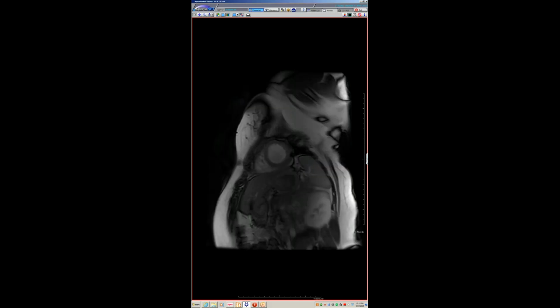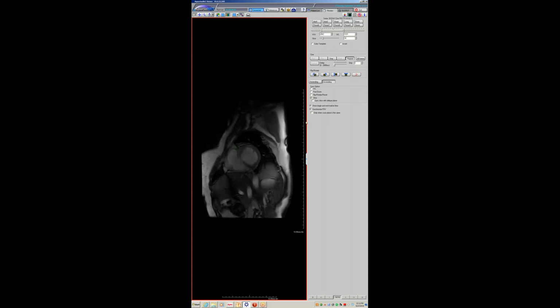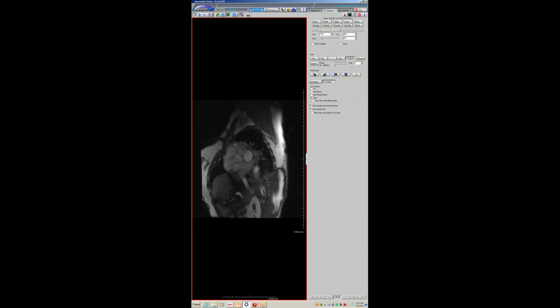So this is interesting because it was a case where a patient had a coarc that was not well repaired, barely repaired at all. And she underwent an MRI, MRA, and there was this thing sitting here. You could see it here. And some people in my section were looking at it. I wasn't on cardiac. And they were thinking it was thrombus in the left atrial appendage, which is odd for the position. Also, the signal in this is not like thrombus. It's quite bright on the SSFP imaging.